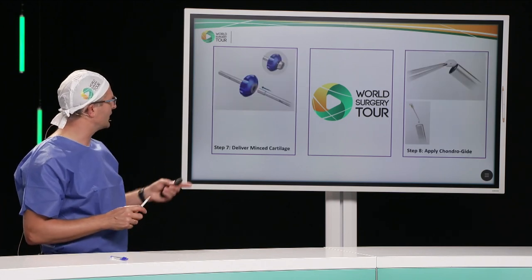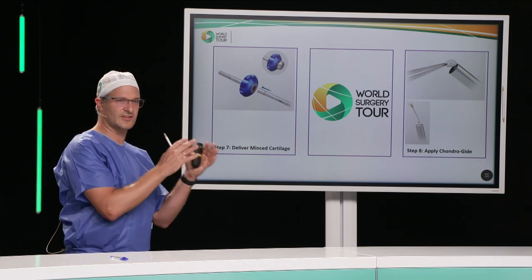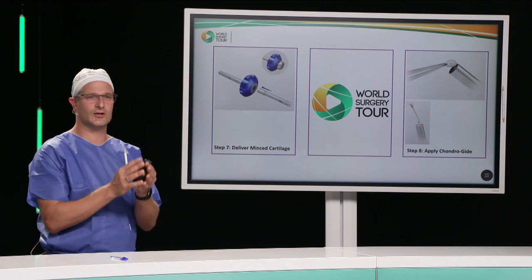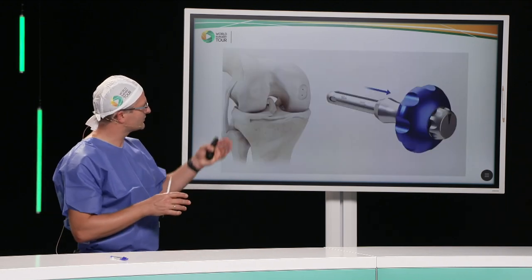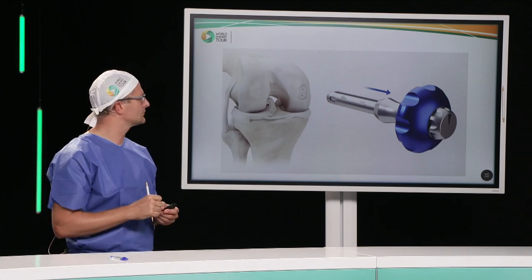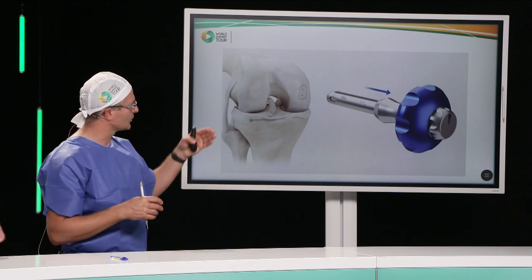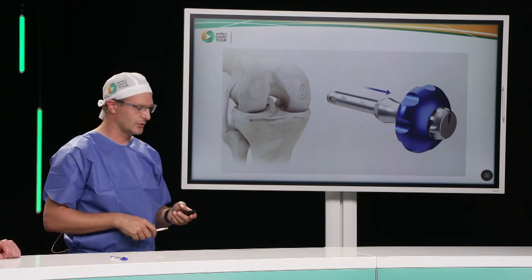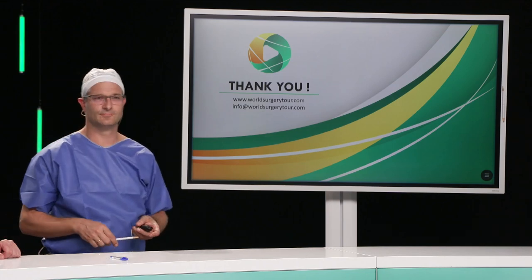And then eventually it will be delivered through a special cannula, either separately, first the minced cartilage and then the membrane, or that's what we're going to try today. We're going to try to apply them at the same time. So this is how it ideally should look like. You can do it as just one singular diameter application, or if the defect requires it, the geometry or the size, you can also apply multiple patches right next to each other in order to find a full coverage of the defect.